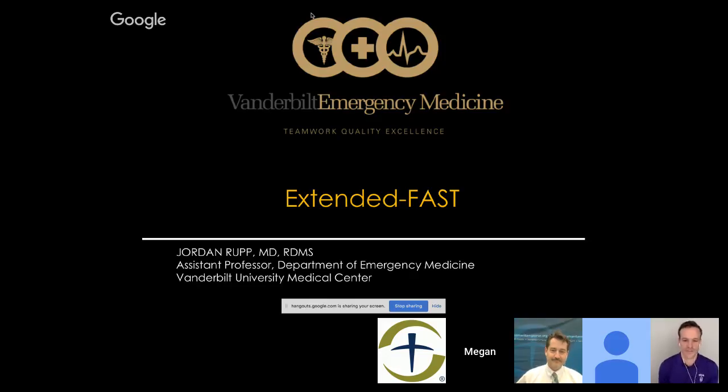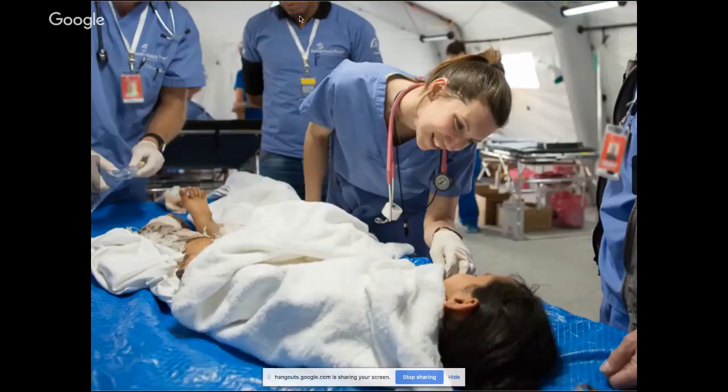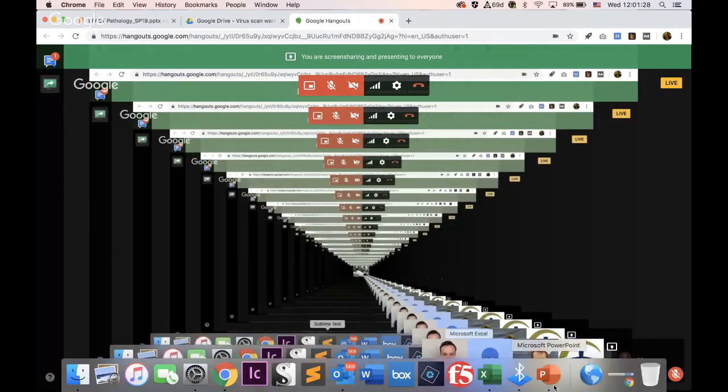Yeah, thanks so much for having me. Excited to talk about one of my passions, ultrasound, and the EFAST exam is the initial point-of-care ultrasound application. We use it a lot in emergency medicine. It has a lot of applications in the global health setting, in missions, whether it's trauma, can help in OB care and going forward. So we'll jump right in. I've got a lot of slides, and we'll move right through. We'll get started with the case. And we can go to the next slide.